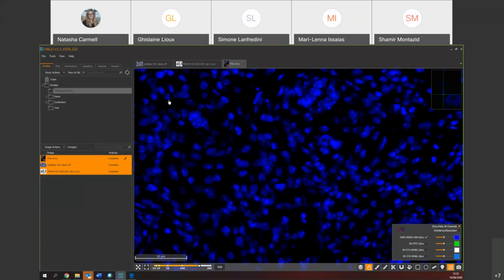Thank you very much for a brilliant presentation. I really, really enjoyed it. In the context of my specific needs, where you have a tumor within normal tissue and want to analyze the tumor, you need to first run an algorithm to identify the tumors, and then run the algorithm to count the positive cells for a certain sort of staining. Is it possible to run those two algorithms together on the image and prioritize which one is done first, for example?